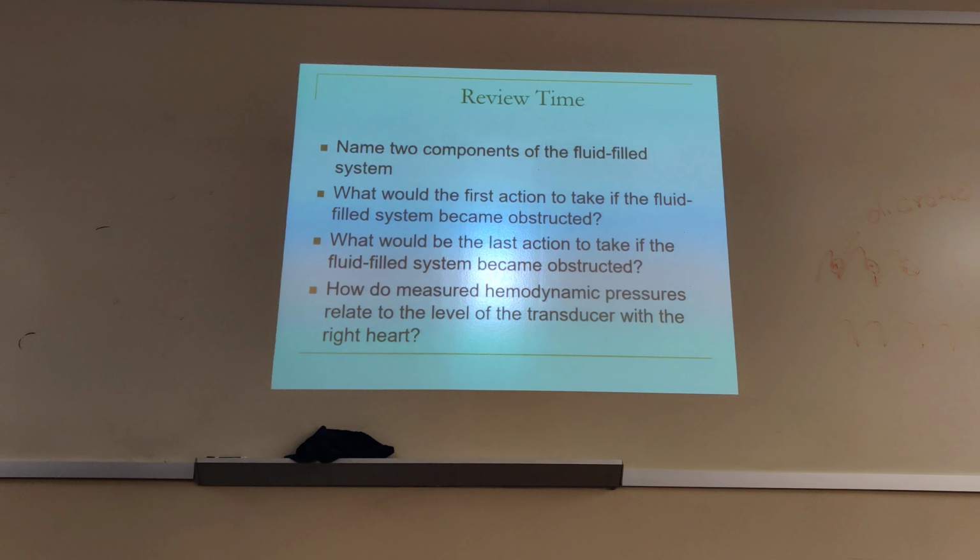If you place it way below the patient, all the fluid is putting pressure on the transducer, therefore the hemodynamic pressures will be falsely high. So what we need to do is make sure the transducer is placed at the level of the right heart. That will eliminate that problem.